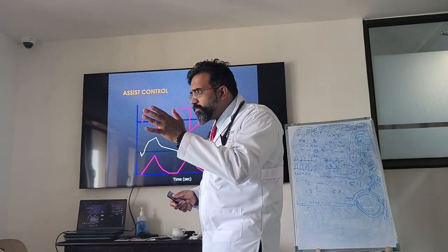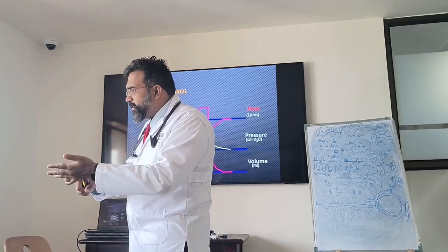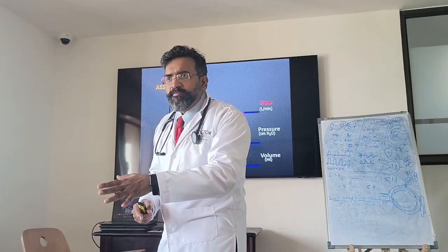So what you are thinking now? There is some reason that is causing this. This patient is triggering the ventilator more often. There is some acidosis, there is some fever, there is some sepsis, there is something somewhere which is triggering this patient. So find the problem and treat that.